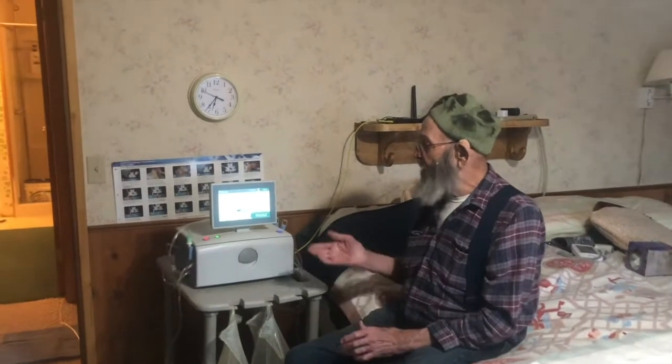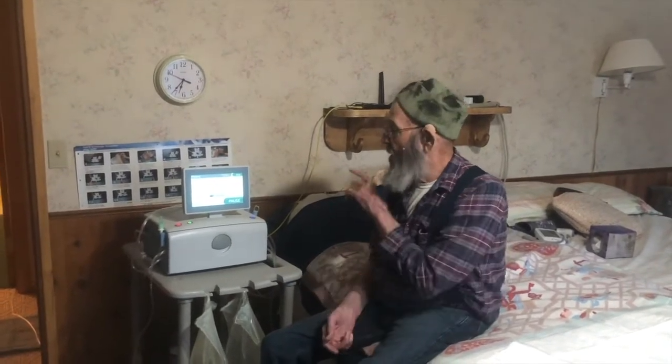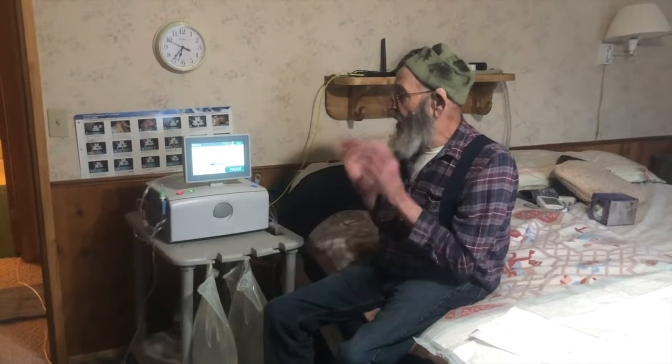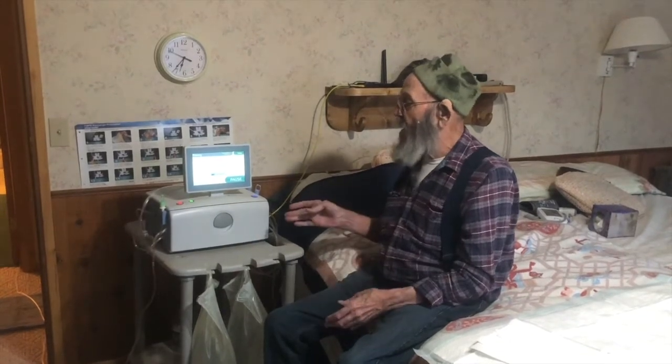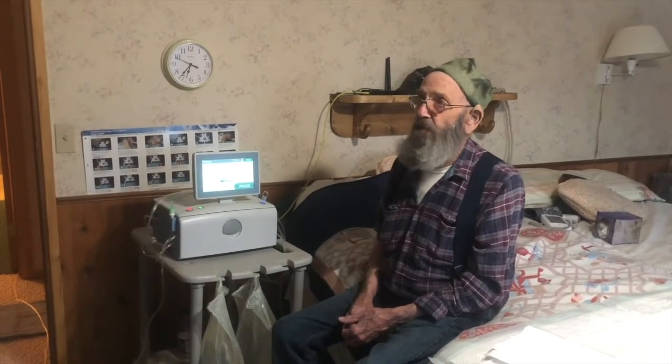It's got so many sensors in it that it's almost impossible for you to get in trouble with it if you just let that machine do what it does. Yeah. You know, we wipe this machine down probably once every week with bleach and stuff, so it's always clean and sterile. But no, everything that is contaminated with body fluid or anything like that goes right in the trash. This machine never touches any of my body fluid. None of my body fluid touches anything in this machine at all. This machine does all of that through that little pump mechanism in there, you know, so none of my fluid ever gets touched in that machine there at all.